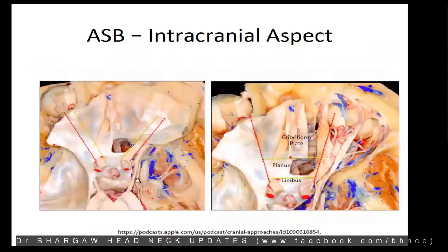Discussing the indications. Here you see the planum, and that's the dura that is still attached in the specimen. Now, when the tumor goes posteriorly towards the planum, this dura is thin and dense, and it is more adherent to the underlying bone. That is an important factor when we decide about endoscopic versus open, which I'll again tell you when we discuss the resectability aspect.